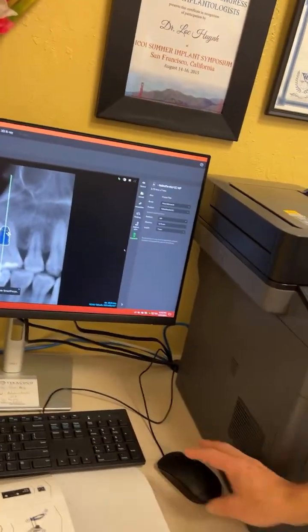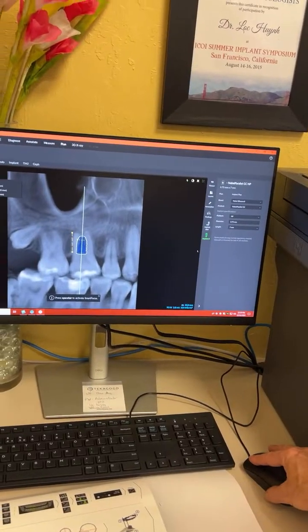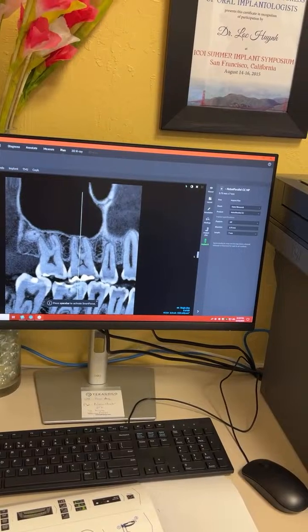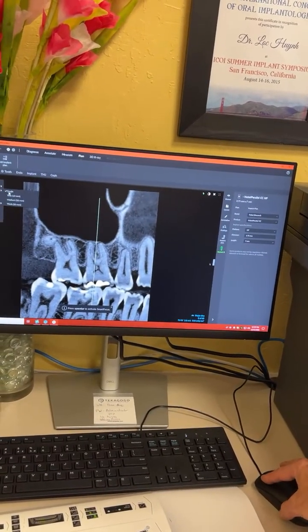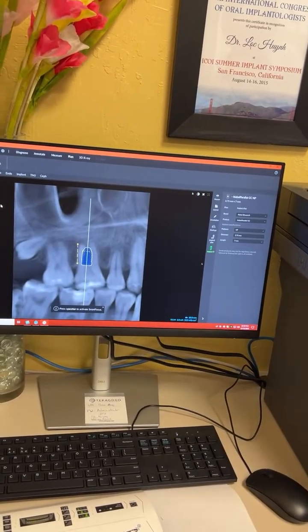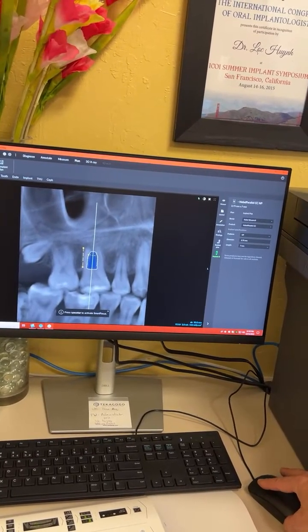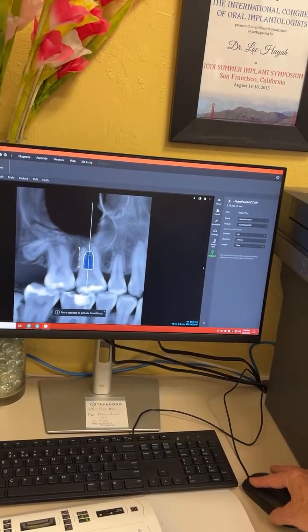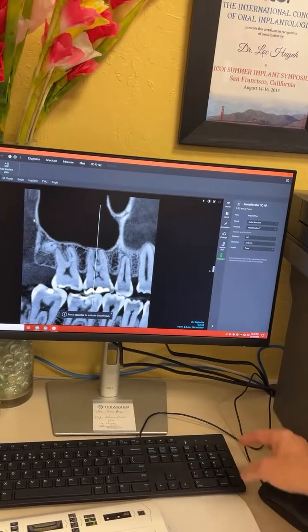Very good. You can change the thickness of this if you want. A slice thickness that's really thin sliced. Look at that. If you want more soft tissue, doctor, you go out here to thick. It's like a pano. Can you go back to what you just did? Oh, just click on that right there. Resize thickness. If you want thin slices, it slices away some of that soft tissue. It's a thinner slice, or you can go really to a single slice.